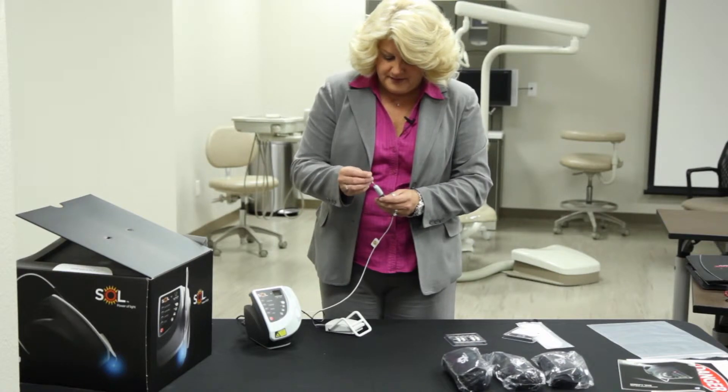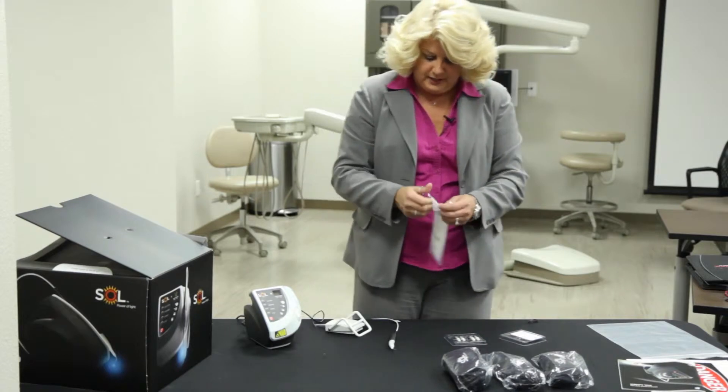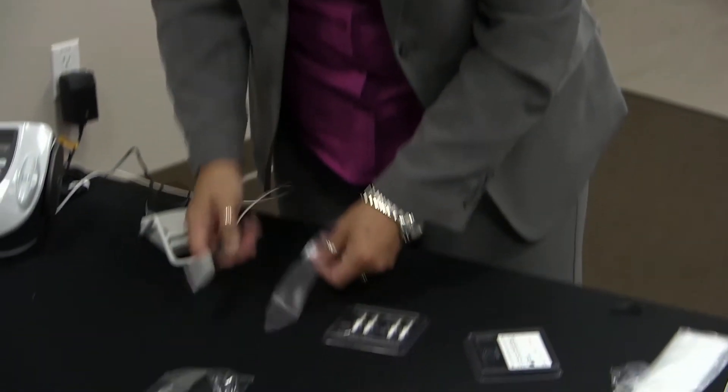If for any reason this gets broken, it does render the unit not usable until you replace the cable. We're then going to slip this inside just like this, and you certainly have sheaths that you can put on beforehand — which we include in here — for asepsis.